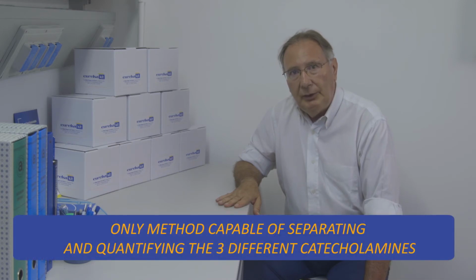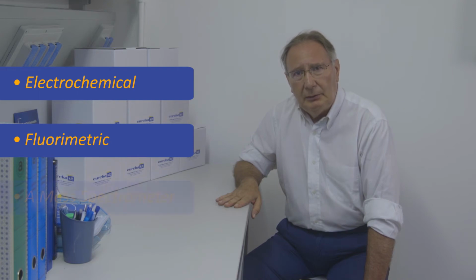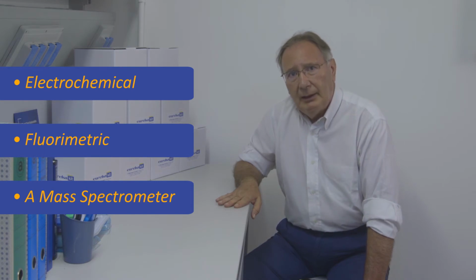However, high mortality rates in undiagnosed cases highlight the need for accurate and rapid testing methods. The method of choice is the chromatographic one because it is the only method capable of separating and quantifying the three different catecholamines. To analyze the catecholamines in chromatography, the detector connected to the HPLC can be electrochemical, fluorometric, or a mass spectrometer.